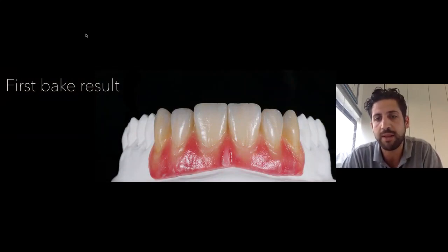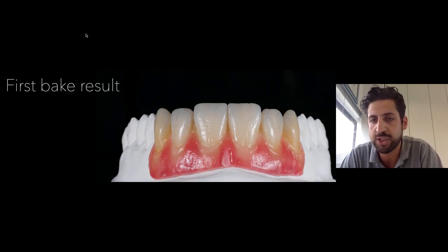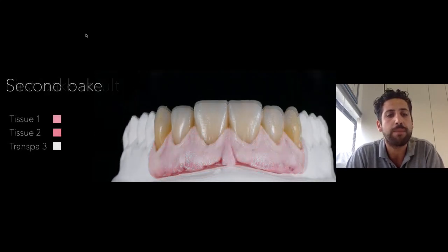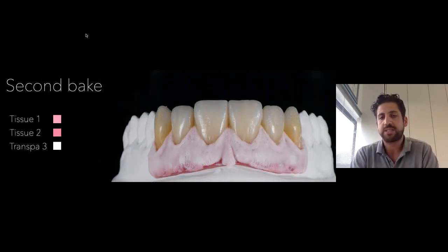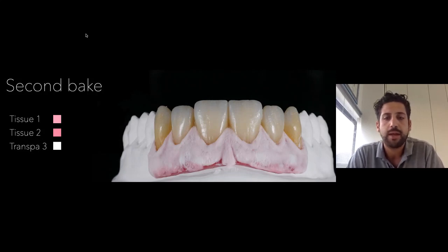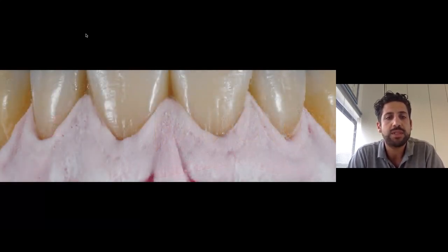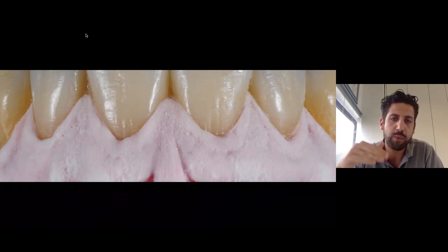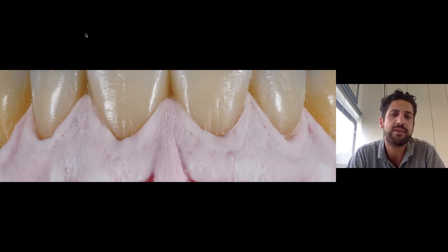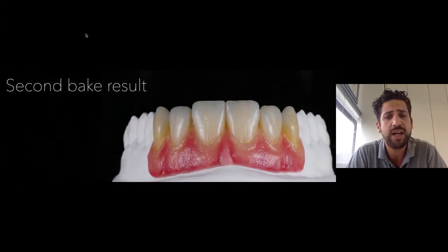We can immediately see some nice effect of the gingiva, but maybe we need a second layering for the shape. We already have some dark color, so now we work only with the light colors, tissue 1 and tissue 2 and transparent 3. This is a picture closer. It's really important to define the limit between teeth and gingiva, also to avoid dirtying the surface of the teeth after the firing. And this is the result of the second bake.